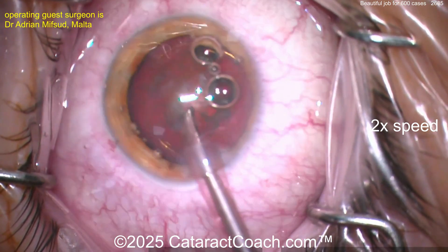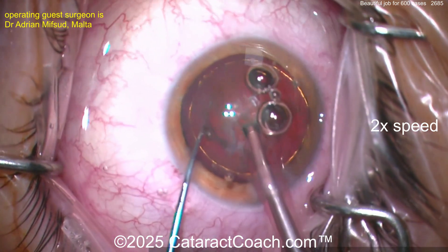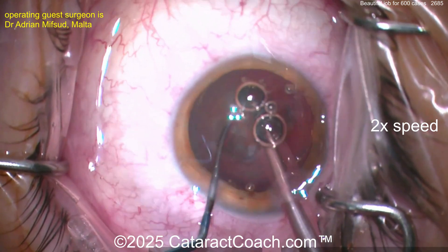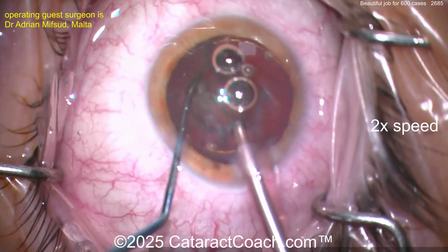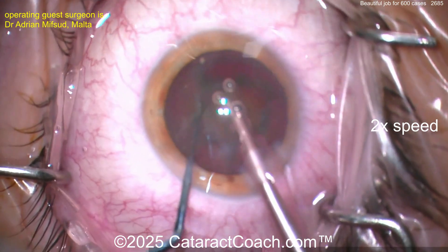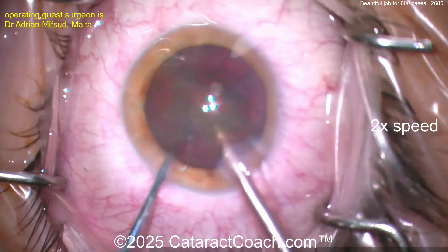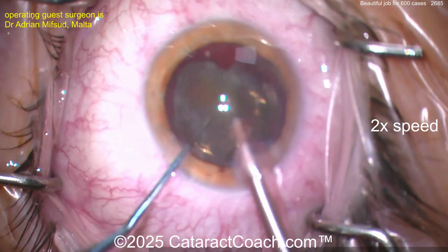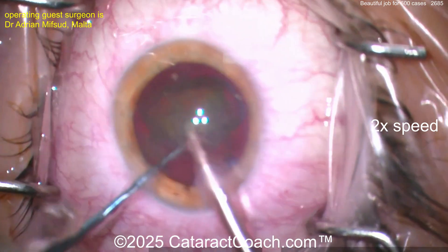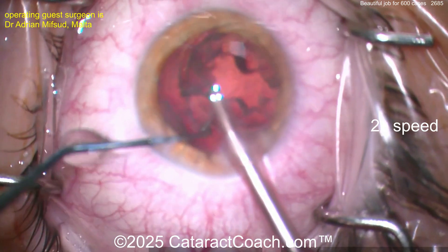Get that probe back in the eye. This video is 2x normal speed, so the case is about 13 minutes — very reasonable. It's not a race. You're going to do a groove down the middle, perhaps a stop and chop. Split that nucleus — aspirate those bubbles out, give yourself a better view. Bring up a half, chop it, bring it up — there you go, just comes right down. This looks like a relatively soft nucleus, mostly posterior subcapsular changes. Now getting the second heminuclear piece up. I like the chopper in the safe position, protecting the capsular bag — that goes nice and easy.